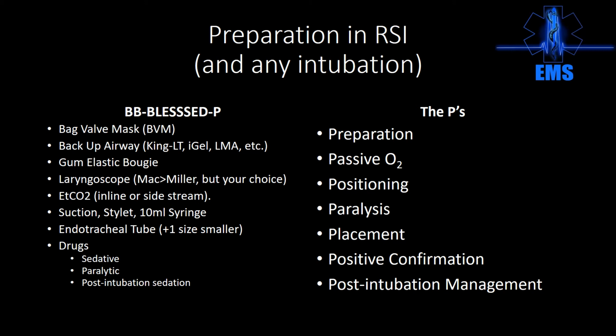End-tidal CO2, and for that matter, monitors. All the monitors need to be on the patient before we intubate. We need to have them set to run, and obviously don't put the blood pressure cuff on the same side as the IV that you're going to use, because that's going to complicate your ability to induce or paralyze the patient. I've done that before. That's speaking from experience.